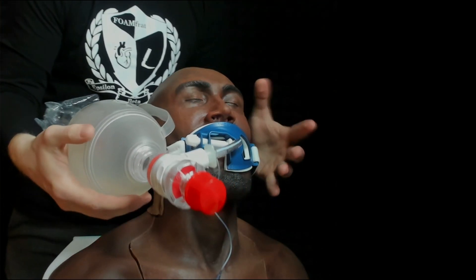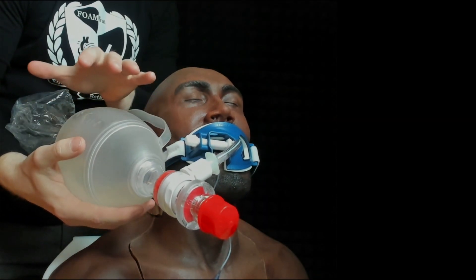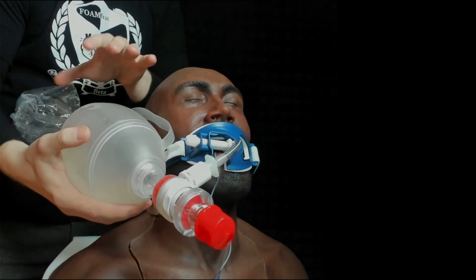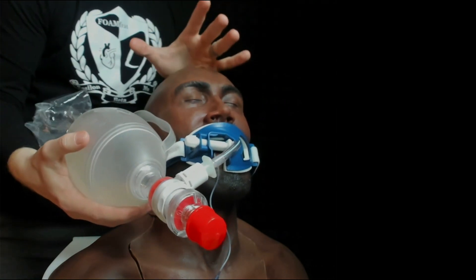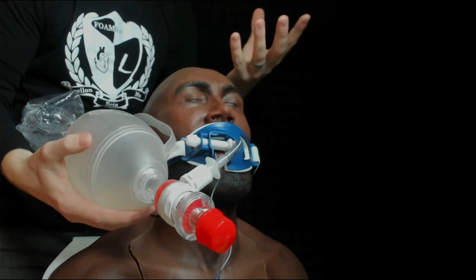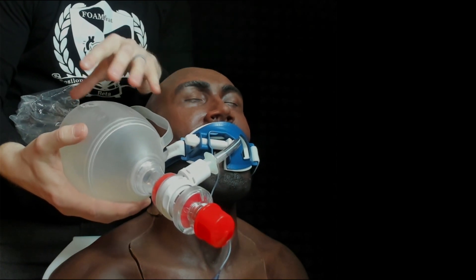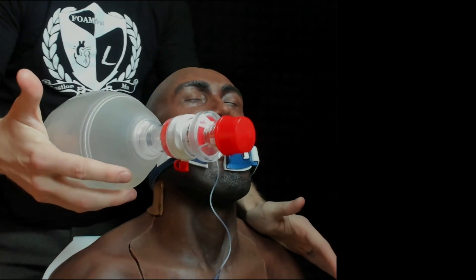We're going to play a game called 'guess the tidal volume.' I have an adult bag valve mask here with a total volume of 1,400 milliliters. I'm going to squeeze it at a few different spots, and before I put the number up on the screen, see if you can guess in your head what that tidal volume is. You can also look up what your bag valve masks hold for total volume.